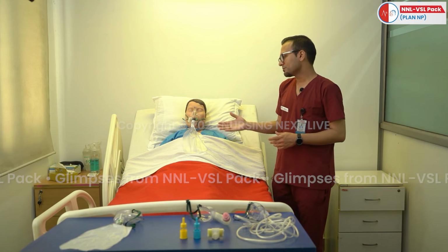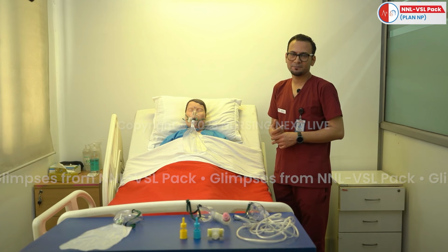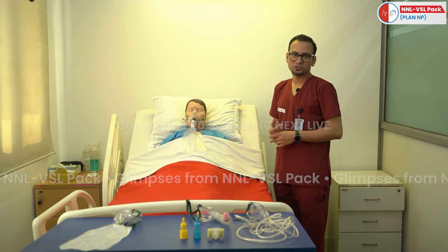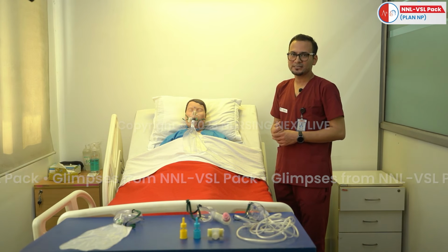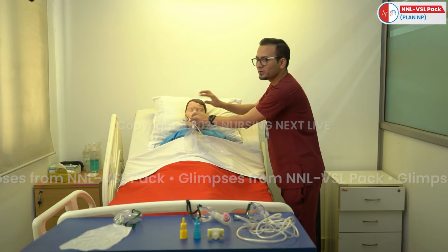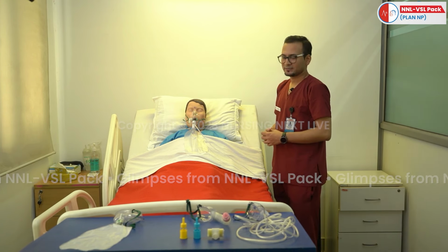This mask is widely used for patients who have carbon monoxide poisoning, patients with physical trauma, and patients who have cluster headache. It is contraindicated for those patients who have CO2 retention, patients with facial injuries, patients who are not able to keep the mask in place, and patients who have a psychological effect from mask therapy. So this is all about the non-rebreather mask.